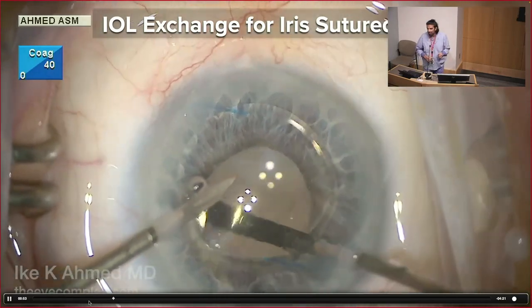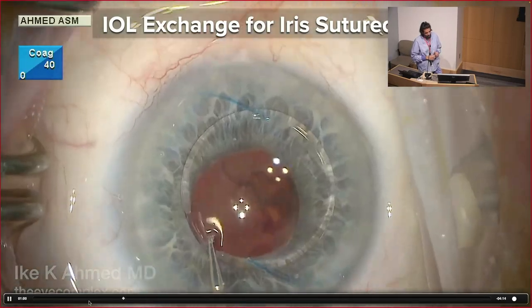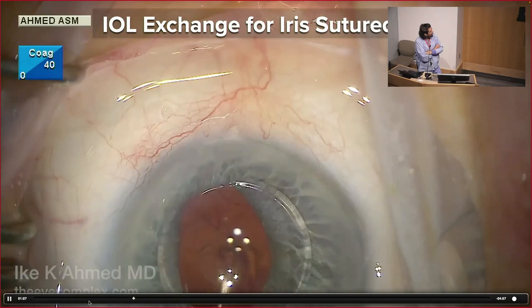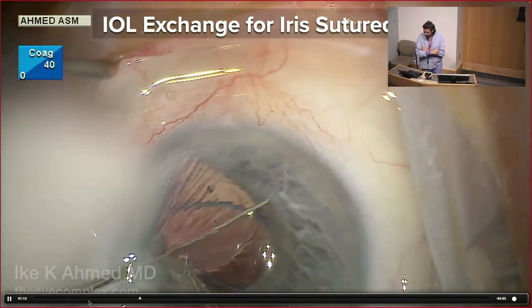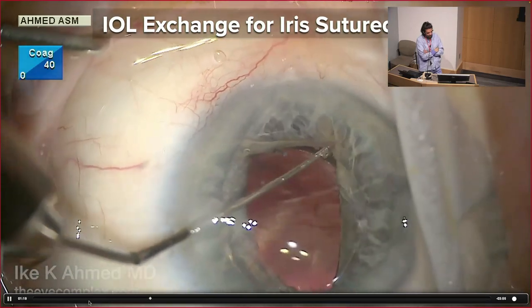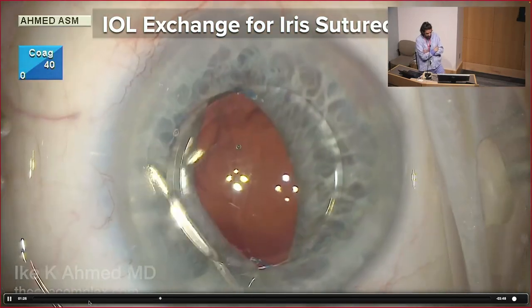The danger is how do you suture that lens to the iris without it dropping onto the retina? We use a pupil capture technique where we capture the optic of the lens in the pupil. This is all kind of done with your third hand in some ways. The haptics go underneath and the optic stays in front, and then Miochol is put in to bring the pupil down and capture it. This technique is helpful to control the positioning here with a pair of micro graspers and a Kuglen hook. And now we bring the lens forward with that hook so we're anterior to the iris. Miochol is put in.